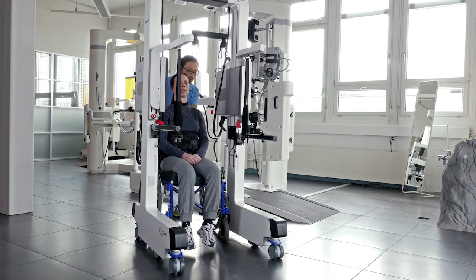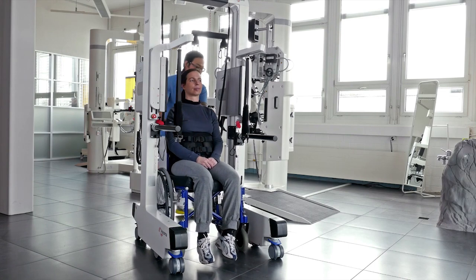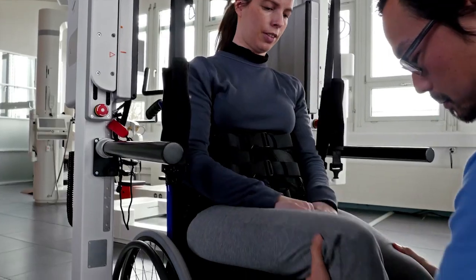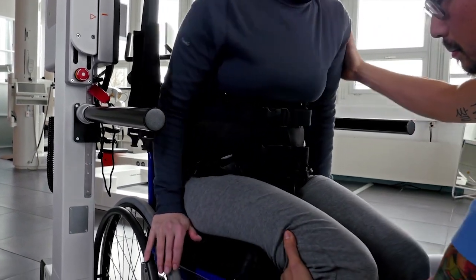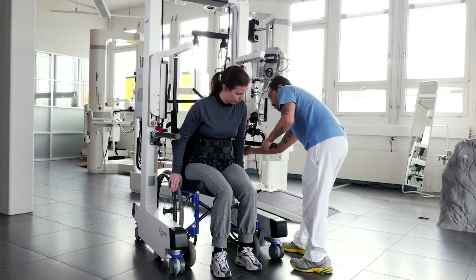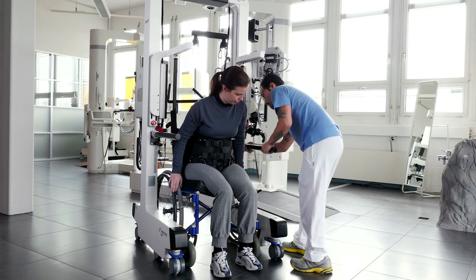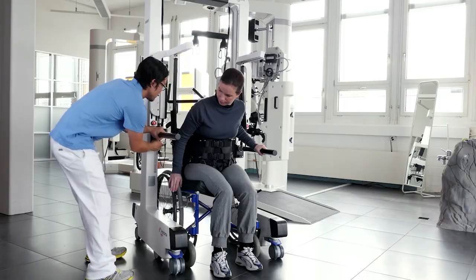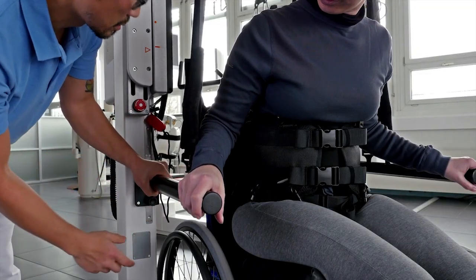Push your patient into the Andago and position the shoulders under the suspension carrier. To facilitate sit to stand, place both feet of the patient on the floor. If you have handrails, the patient may use them to support and stabilize himself during sit to stand. You may need to adjust the height of the handrails or remove them according to your therapy goal.